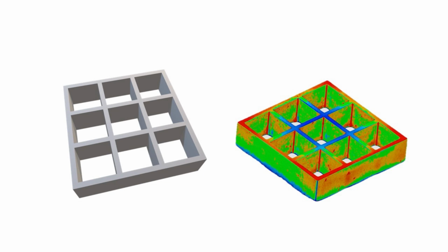As seen in the image on the right, our goal is to identify the scale at which the error values of the inner and outer surfaces become similar. The scale applied at this point represents the magnification needed to compensate for polymerization shrinkage, ensuring that the model is printed true to its design. Furthermore, the value of the error protruding outward indicates the amount of overextrusion. By quantifying this, we can adjust the printer settings to minimize overextrusion.